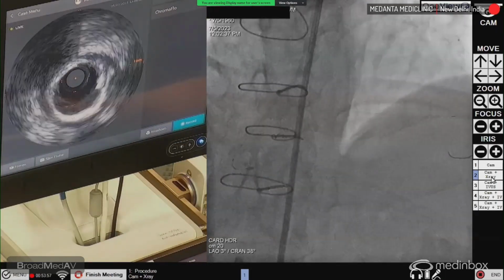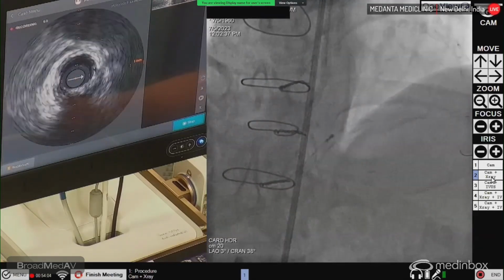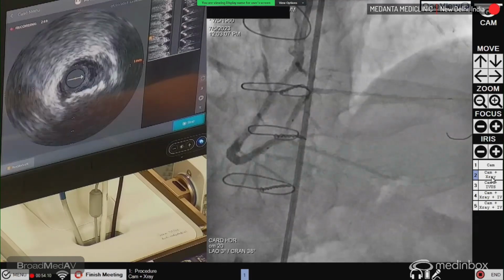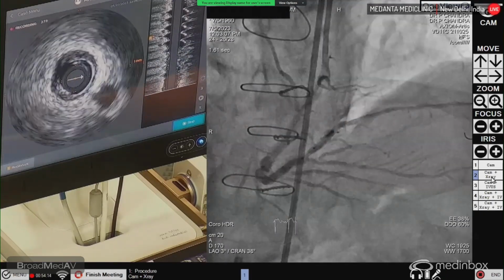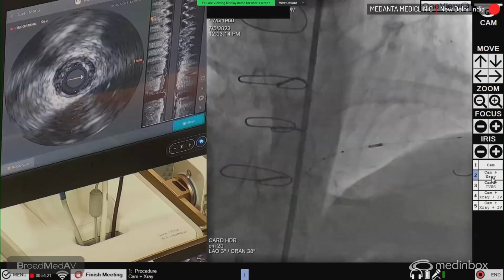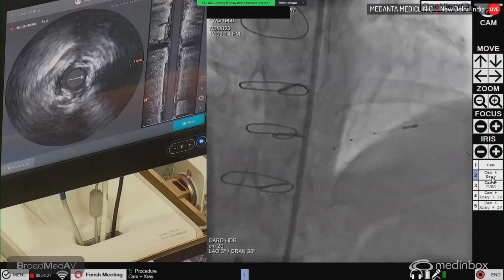Okay. So up till now, it's okay. So here, this is the calcific point. Can you check now where we are? Okay, so this is the point where calcium is starting, and so we might have to do a long one. This vessel is looking like a 2.5 at least, which on angio was looking like 2, and all of this is diseased.